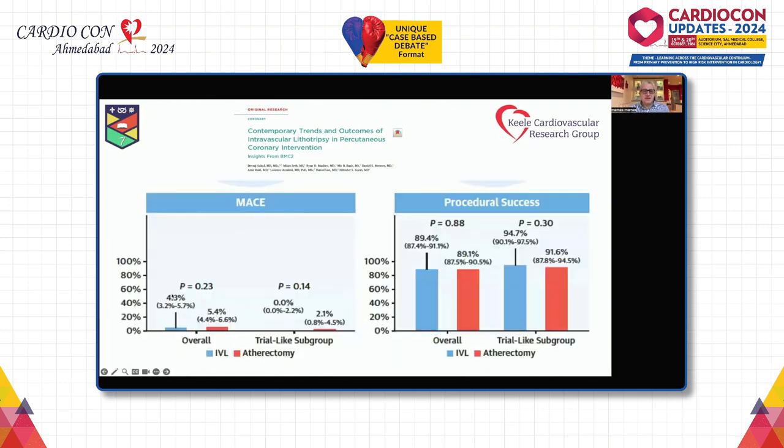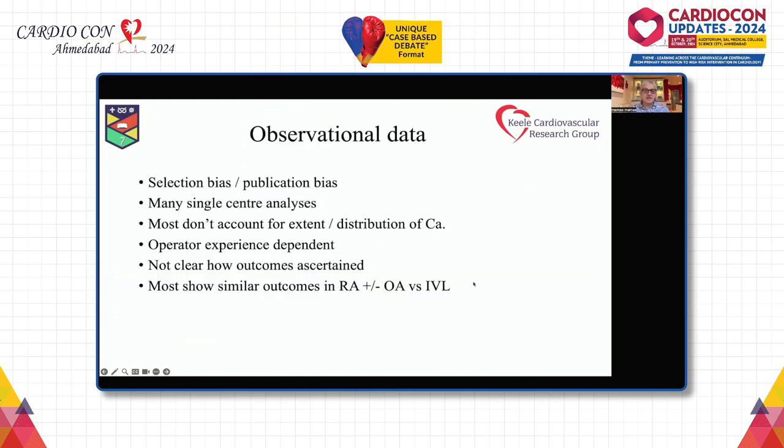And again, you can see that in terms of MACE, whether they looked at the whole cohort or the trial-like subgroup, absolutely no difference in outcomes, and again, no difference in procedural success between the techniques.